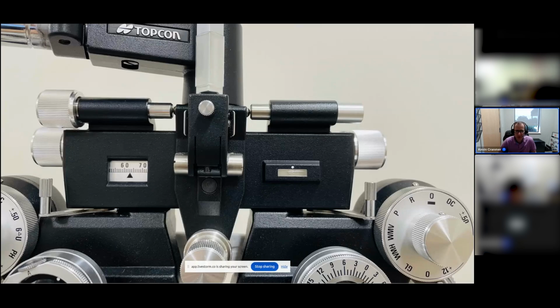You can see that vertical silver thing just to the right of the Topcon label, and there's a little knob that attaches that. That's a rod that comes out the top. It may or may not be present on the phoropter you're using. It's called Prince's rule. It's used to check near vision, and it should be in the vertical position when you're doing your refraction.